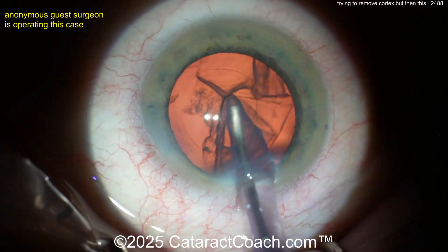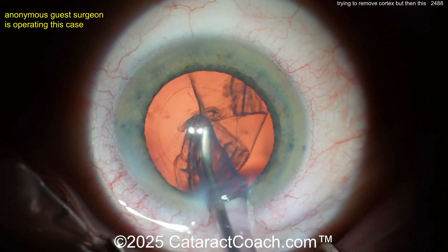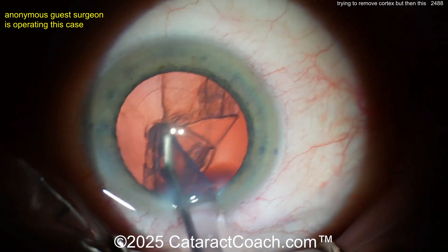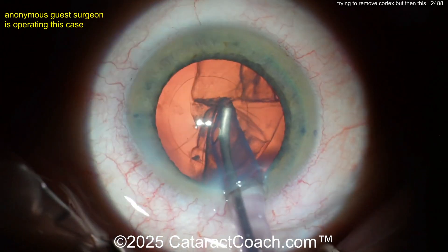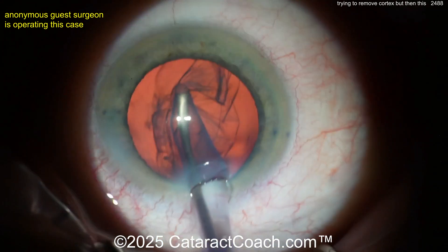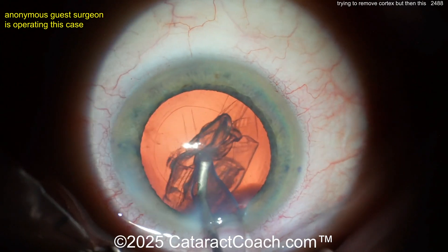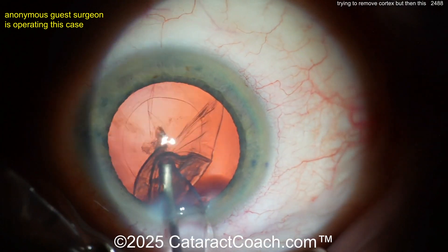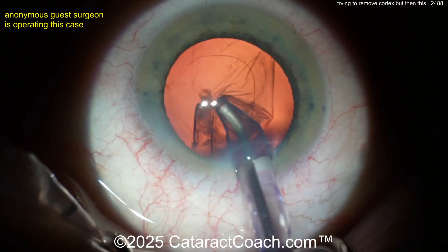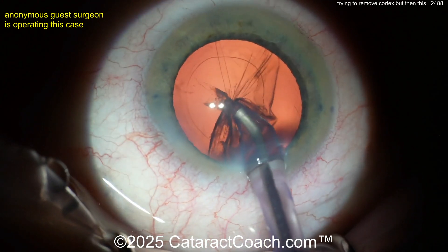Again, trying to pull the cortex up — here's where a bimanual approach would be easier, because you could use the infusion from the bimanual to hold that temporal side rhexis on the right side of the screen, while the other hand uses the aspirator to get the cortex out. But just trying to remove this without any counter-traction from the capsular bag — that's the issue. You got some of the cortex out, but the zonulopathy has gotten worse.